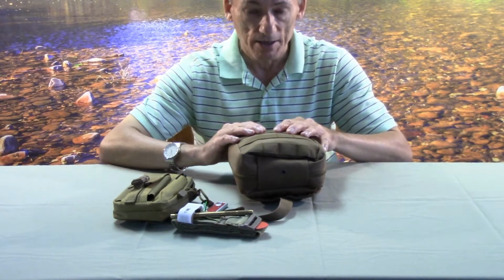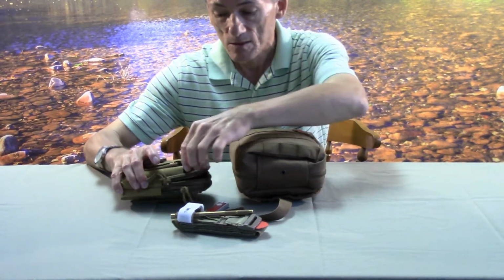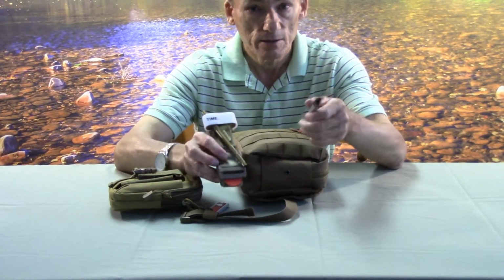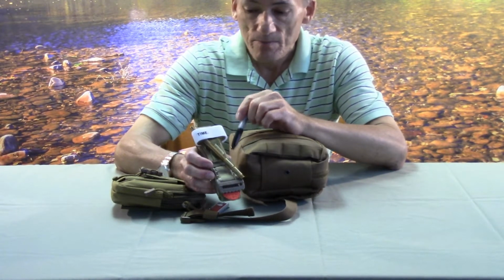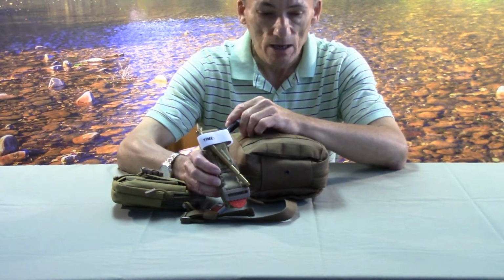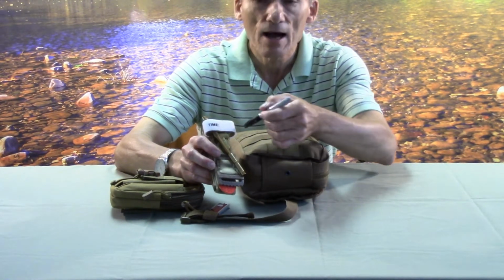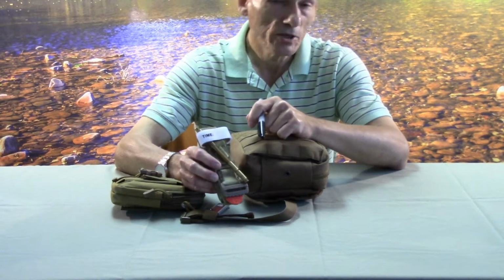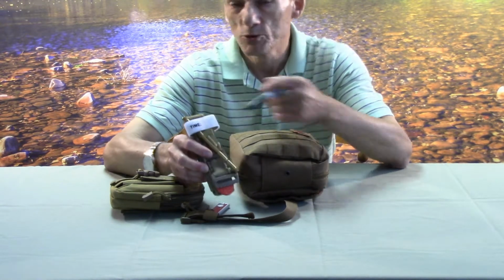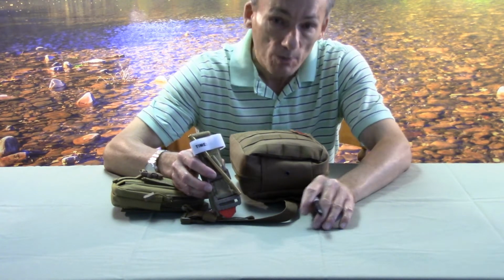Again, the review is more on the pouch, but I'm going to mention a few things here that I think you want to include. One is a simple thing like a Sharpie. Now, again, I'm going to have to get back into the tourniquet here to indicate why. When you apply a tourniquet, you're really cutting off the circulation to the limb below it. I'm not going to get into how to apply these. I may do that in a later video, but you always want to write the time that you put the tourniquet on. The reason is if the tourniquet is left on the limb for too long, the individual could actually end up losing the limb. They'd have to amputate. And we really want to avoid that if at all possible.